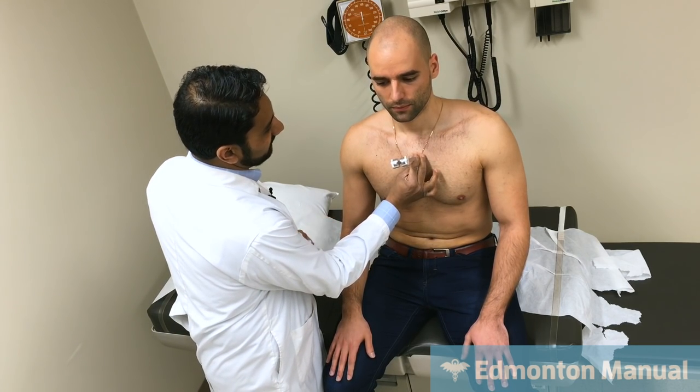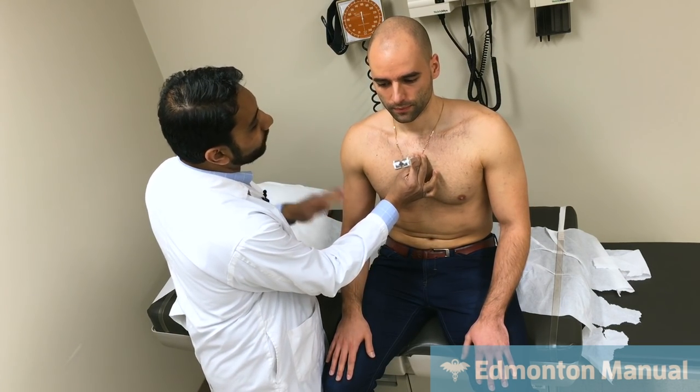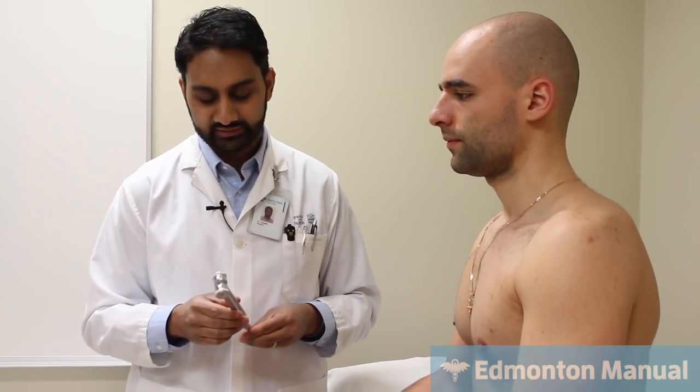Can you feel the vibration? Yes. Okay, so remember what that feels like. The reason why that's important is sometimes people can just feel it pushing their chest without realizing it's vibrating. But now that he knows what vibration feels like, we can now test a different part of the body, okay?